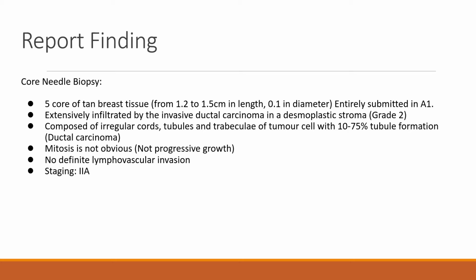Intermediate grade ductal carcinoma in situ component with solid growth pattern and comedo necrosis is seen in the specimen. Comedo necrosis describes a situation where the entire breast duct is plugged and there are dead cancer cells scattered among the live ones. It is categorized as high-grade DCIS with a high risk of escalation. There is no definite lymphovascular invasion noted, which means no lymphatic spread and blood spread of the cancer cells. It is confirmed that the patient suffers from invasive ductal carcinoma grade 2 with staging 2A.